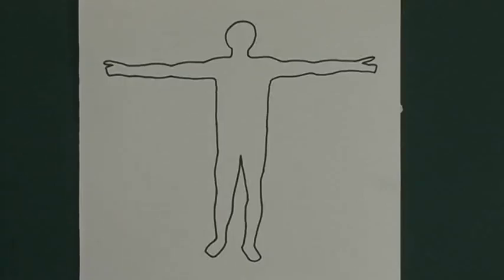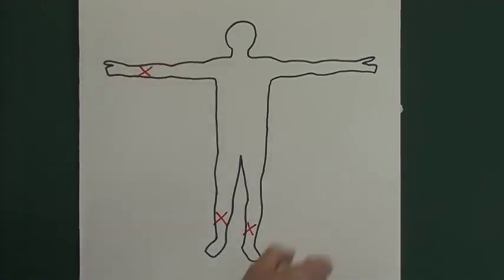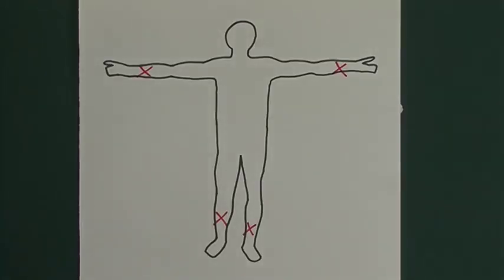So in a 12-lead ECG, we are provided with 12 views of the heart. So how does this come about? Because we've got an electrode on the patient's left leg and on their right leg, on their right arm and on their left arm. And we have, as we'll see later, 6 chest electrodes. 6 electrodes on the chest.